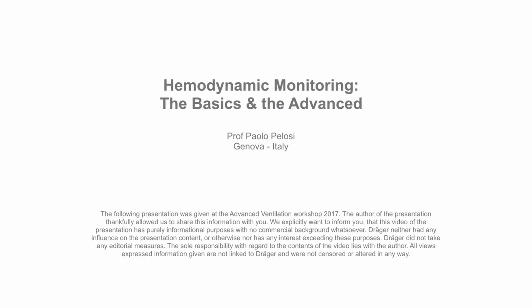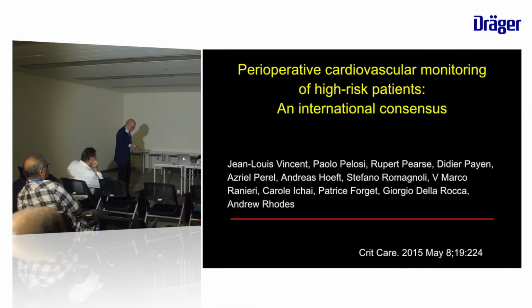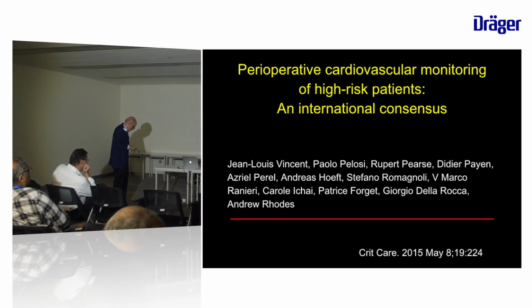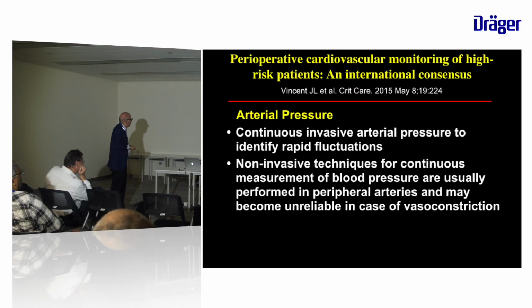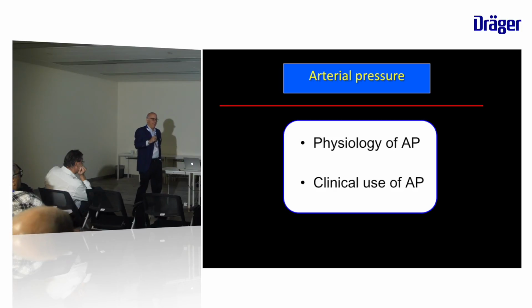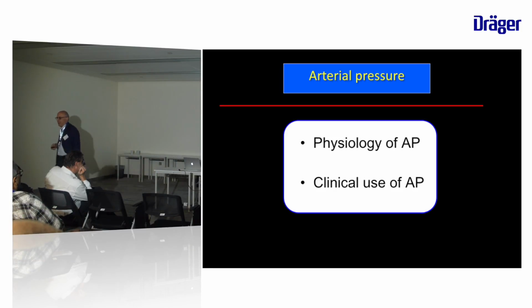So this is a sort of review that we published 2 years ago, and for those of you who are interested, there are many other publications on this topic. You can have a look at that. First of all, I would like to discuss some easy things related to the arterial pressure curve.